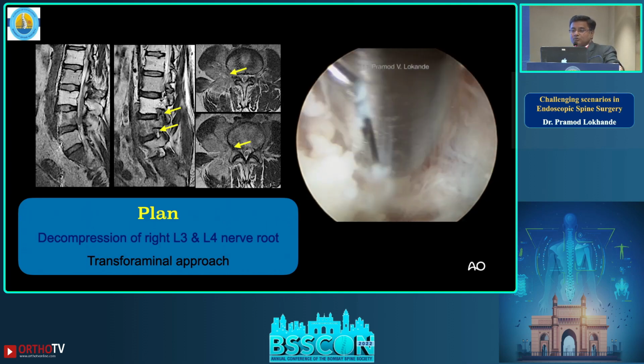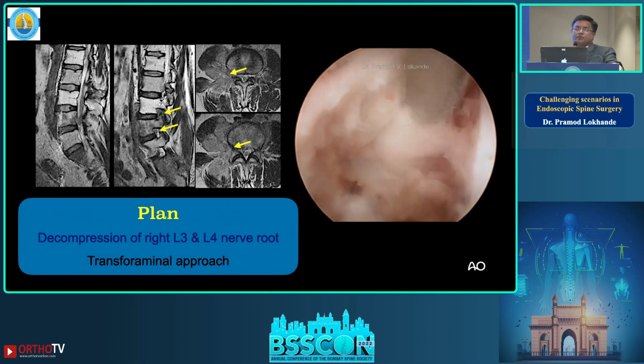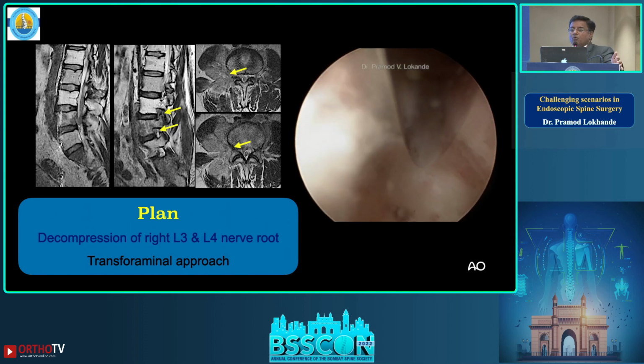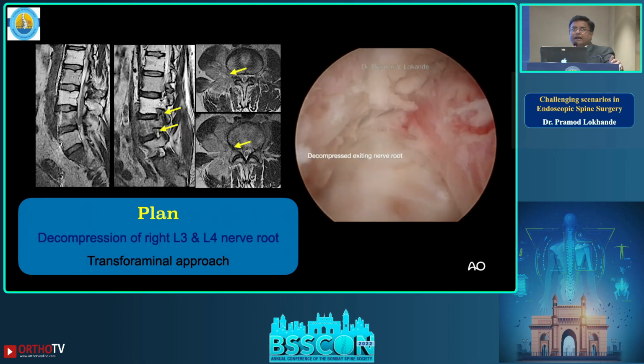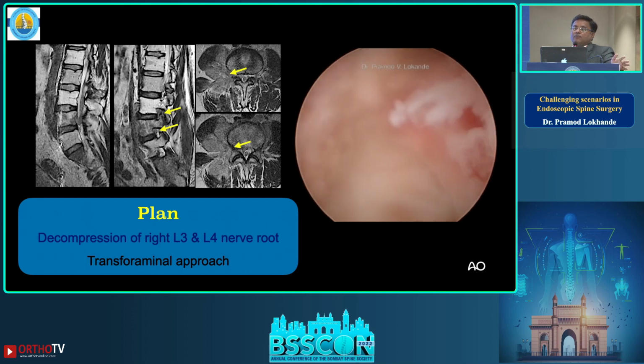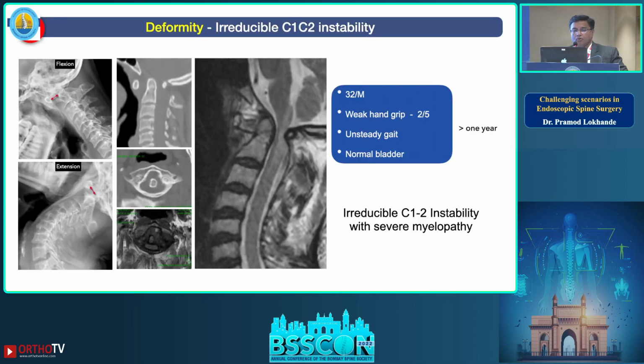Now the tricky situation in this case is that the anatomy is absolutely obscured. You don't know what is where. So the only friend of yours is the bone. You just land on the bone and you palpate. It's like entering a dark room with no lights on, and you just have to go with your gut feeling. And this was the final decompression of the nerve root. The patient became completely pain-free immediately after surgery, and I had almost 6 to 7 months follow-up, after which I think he developed some kind of complication, and he is no more.